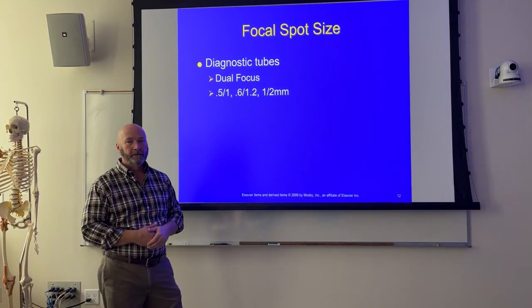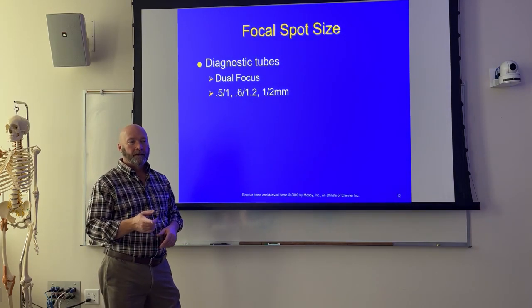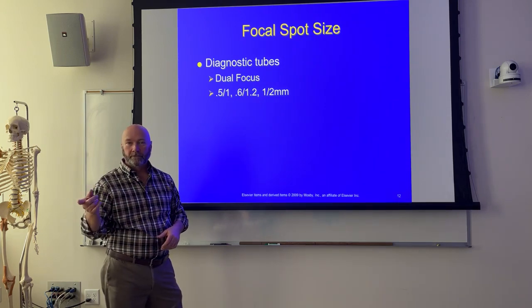What are you going to get? It's going to change it. It's not going to let you do it. You're going to get tube overload, right?